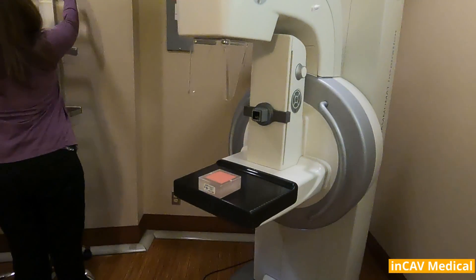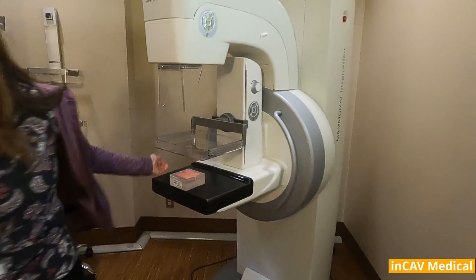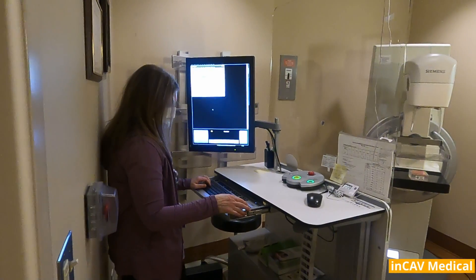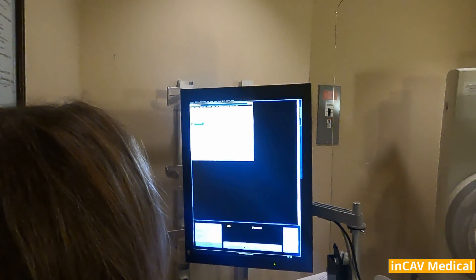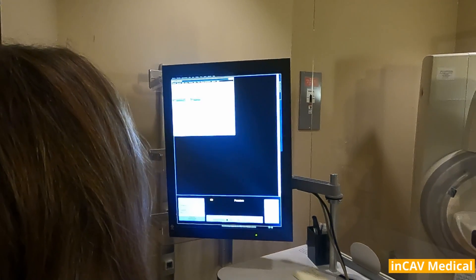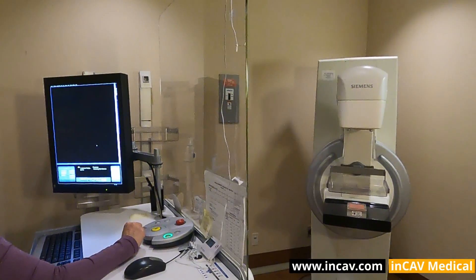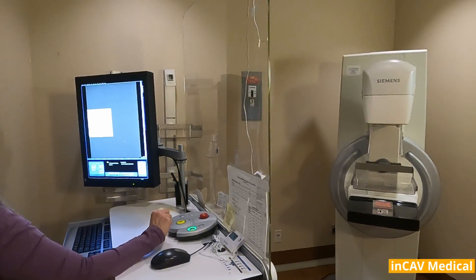Now we are going to do a phantom reading for the calibration, so we are going to use the flat paddle. At the workstation we start preparing the machine to do a calibration. This is really fast and you will see the image is really high quality and high resolution. First we need to adjust the paddle with the foot switch and then we proceed with the reading. The paddle will rise up after we finish the reading.